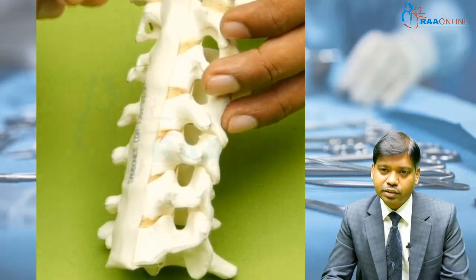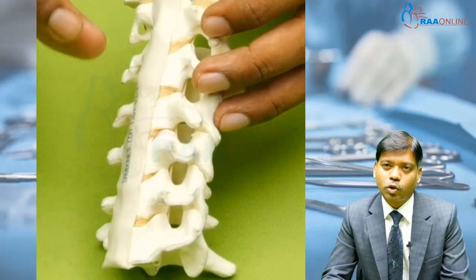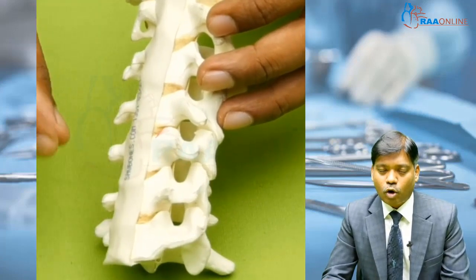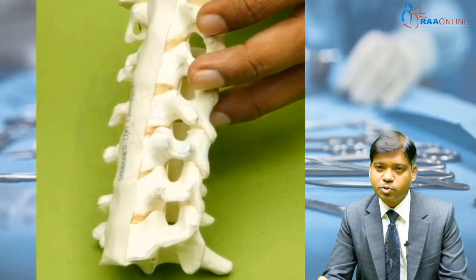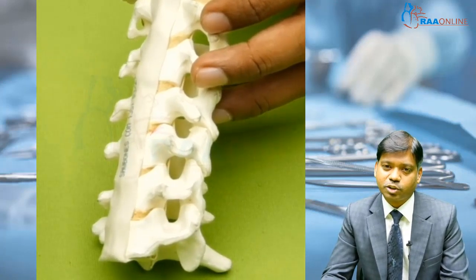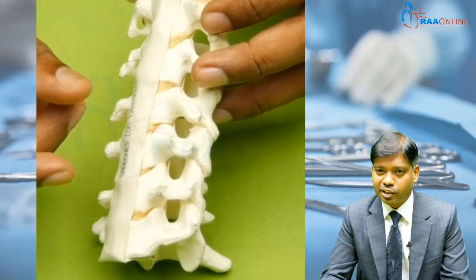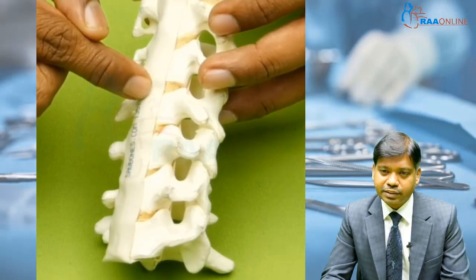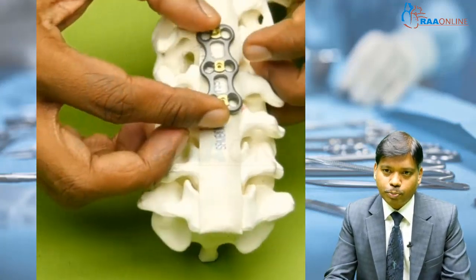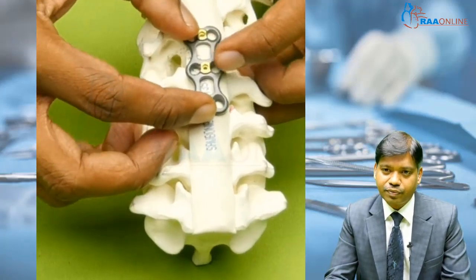So you pack that portion with autologous bone graft taken from the iliac crest, or you can place something called a spacer. Spacer means it is just a cage. For the cervical spine there are cages called cervical spine cages. You place the cage and then you place the plate. So how do you place the plate?